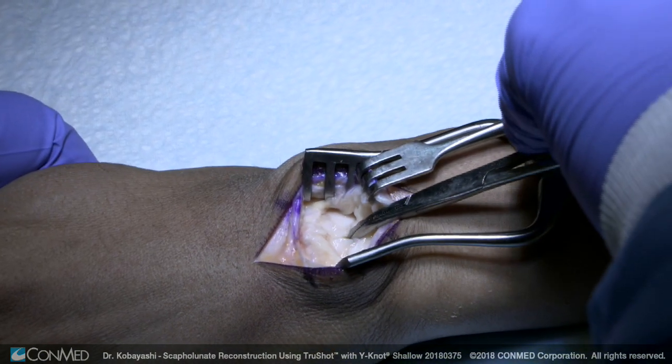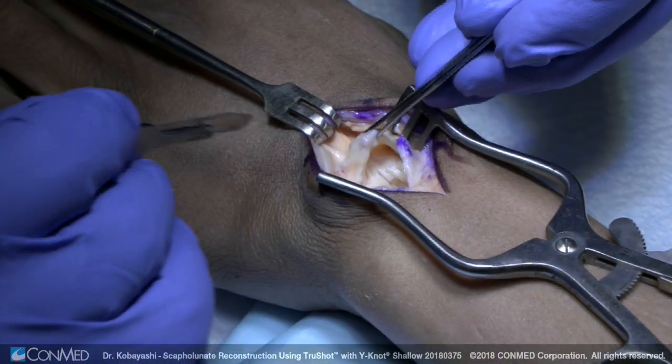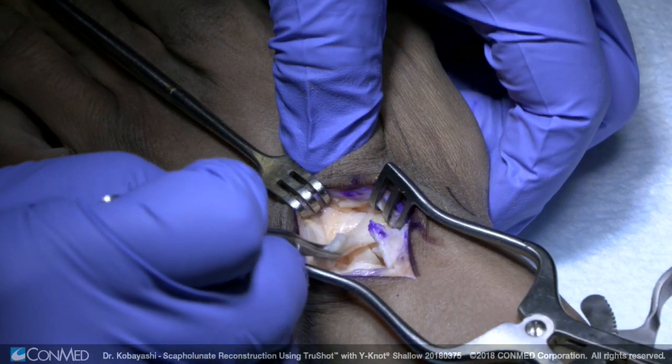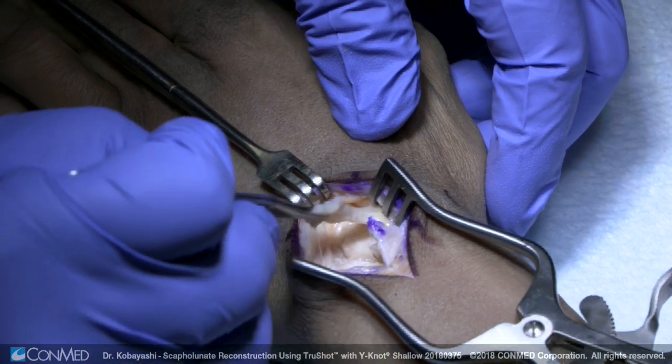There's the ligament tear right there. We're going to use the dorsal intercarpal ligament to reconstruct this. Here's the dorsal intercarpal ligament right here — I like to take a pretty good strip of this. Oftentimes you'll see that when you pull on it, it really takes that scaphoid and takes it out of flexion, and this will be kind of a reduction maneuver.